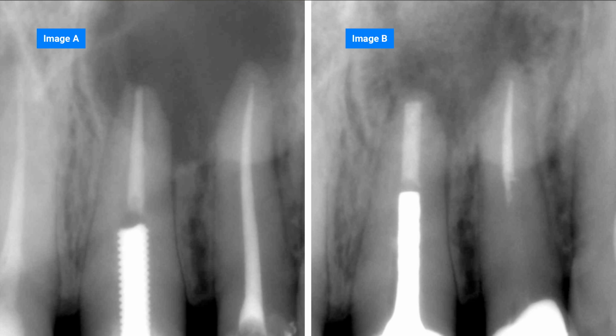In that study, and in other studies like it, there is no mention of the obturation system that you use having any effect on the outcomes of treatment. Here we can see an image of a very large apical lesion that has resolved nicely, but the reason that has resolved is not down to the obturation that I've used. So, on the basis that there are dozens of techniques out there, lots of materials for obturating root canals, and there is no evidence that one system is any better than the other, aside from maintaining apical control, really it's down to choosing a nice, simple system for obturating root canals.